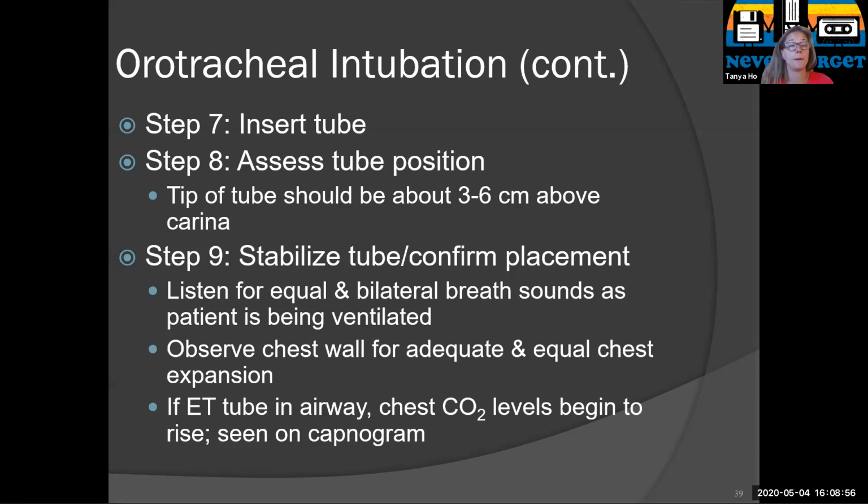And then if you don't hear any gurgling, that's great. Then you also see it accompanied with CO2 detection on the little detector. That's great. The other way you can tell is by seeing chest rise, and seeing bilateral chest rise. So if you only see unilateral chest rise, it means you've probably right main stem intubated the patient. But you want to see chest rise, and then you can also see some condensation in the endotracheal tube. That's from the exhaled condensation.